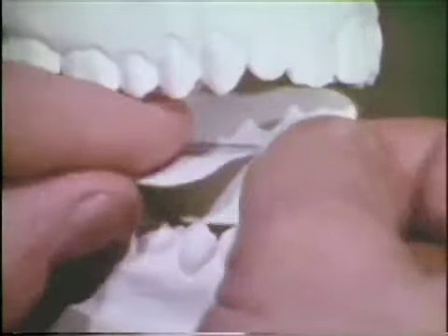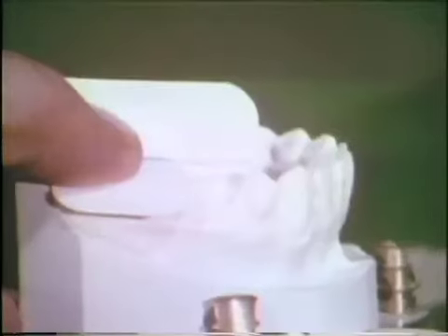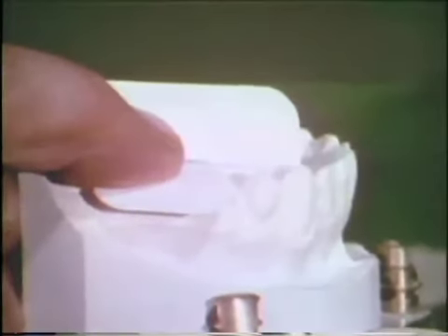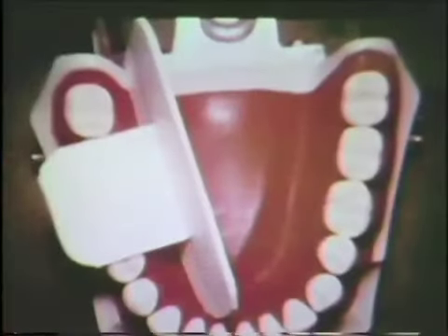As the patient opens, the film is introduced horizontally and rotated into position. The packet is positioned with its anterior edge aligned with the center of the cuspid. To do this, it is necessary to position the anterior edge of the packet lingual to the mandibular central incisor. The position is illustrated on this model. Note that there is considerable space between the bicuspids and the correctly placed film packet.